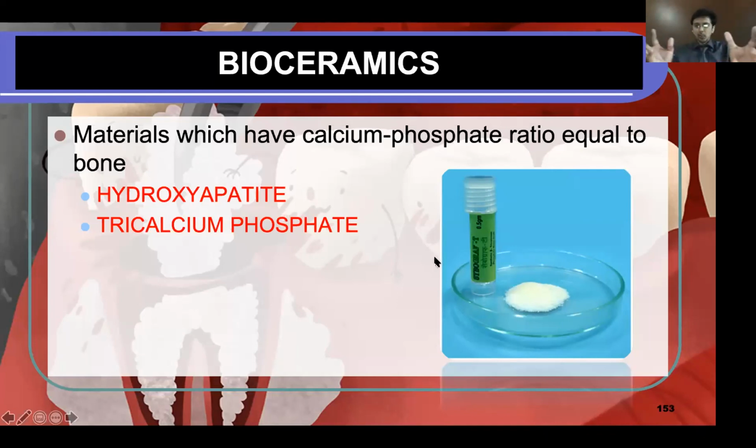What they have done is they have gotten a calcium phosphate product which has a calcium phosphate ratio equal or almost equal to that of bone. Now the problem with using this category of bone grafts is, even though they might have mixed calcium phosphate properly, the resorption depends on the sintering temperature, the temperature at which that thing was synthesized. Are you getting a point?